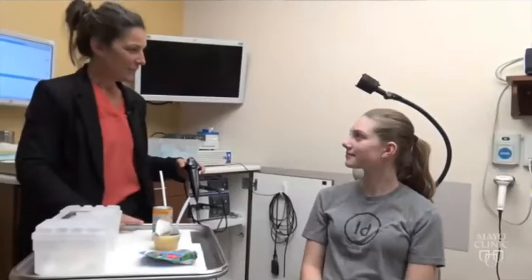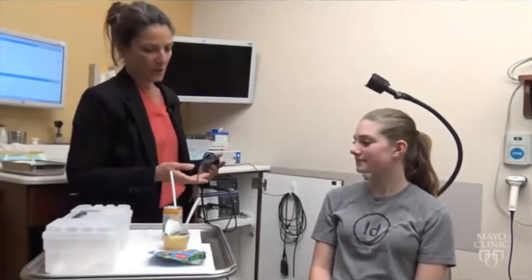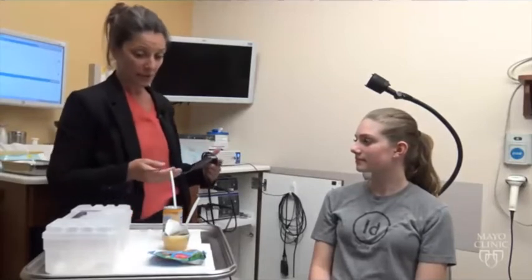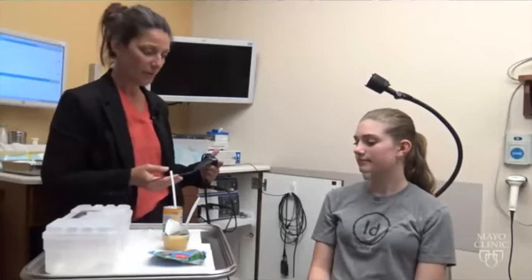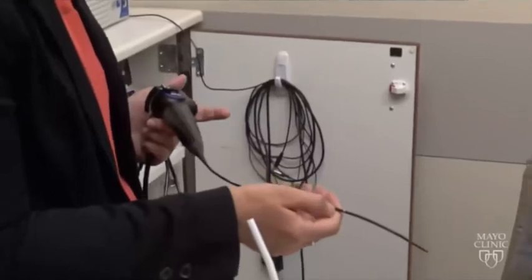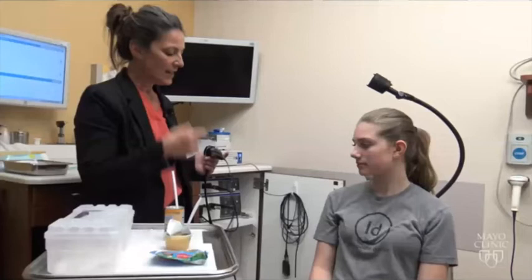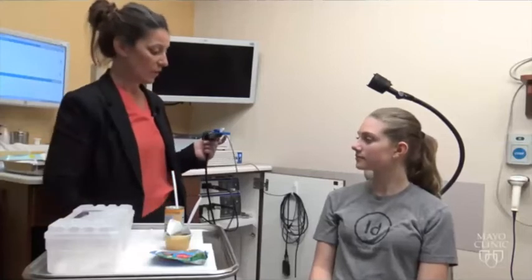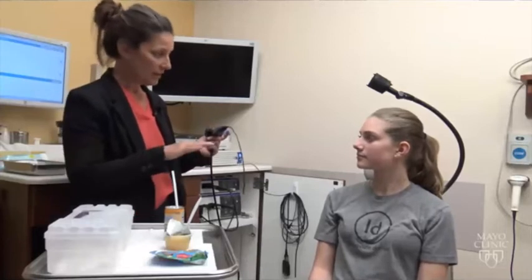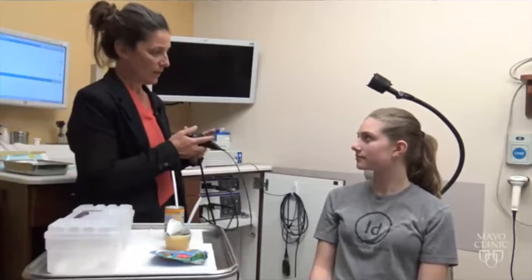Hi, Addy. I'm Carrie. I'm a speech pathologist. I'm going to be helping out with the evaluation today. We're going to be doing a type of swallowing evaluation where we put a camera in your nose and we give you different consistencies of food items to swallow and watch you swallow those. This is the camera we're going to use. It goes in your nose about this far, just a little bit past that white line. There's not much space between your nose and your throat, so it doesn't have to go in very far. We're not in there very long, just long enough to take a look around at the anatomy, give you a couple of things to eat and drink, watch you swallow those, and then we come out, okay?